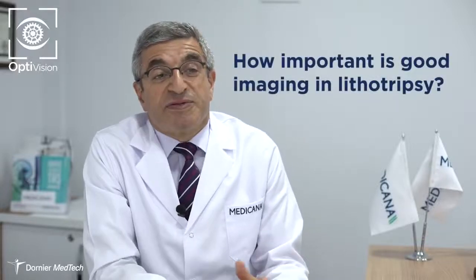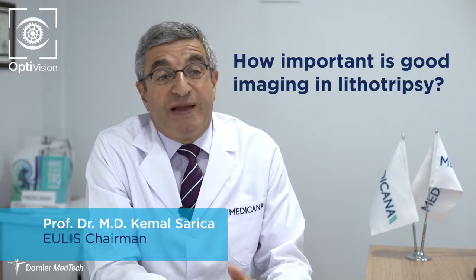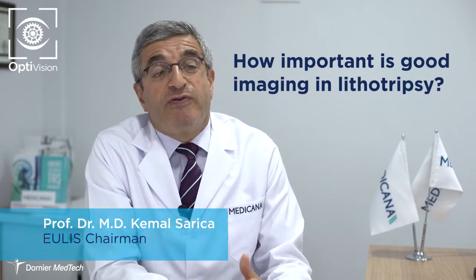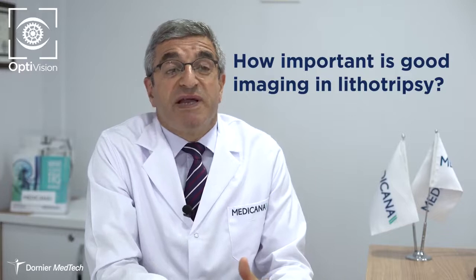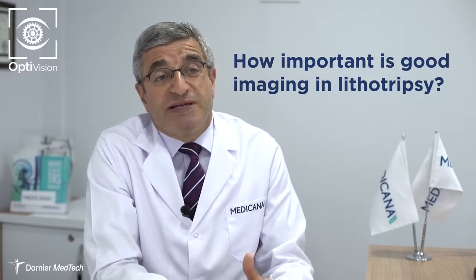Imaging during lithotripsy is an important issue. If you see the stone or stones well, then you will have the chance to treat them in a successful manner. Of course, we need good imaging, but we may have some difficulties. Difficulties may be related to the patient himself or herself or to the stone's characteristics.